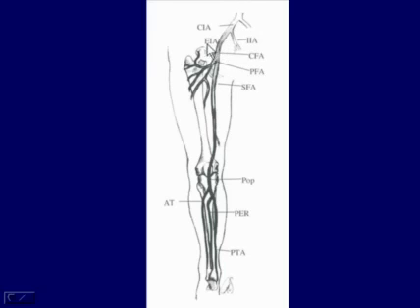Hopefully, if everything looks good here at the common femoral artery and our waveforms are acceptable, we can continue on down distally and incorporate really the bulk of the lower extremity exam. Just down from the common femoral, we're going to include the profunda femoris, or deep femoral artery. We don't really get to follow it for too long, but we'll examine it, as it's a major supply to several large muscle segments in the limb.